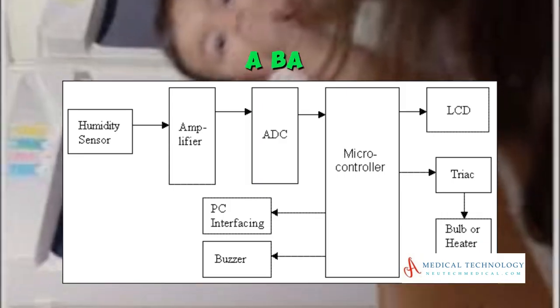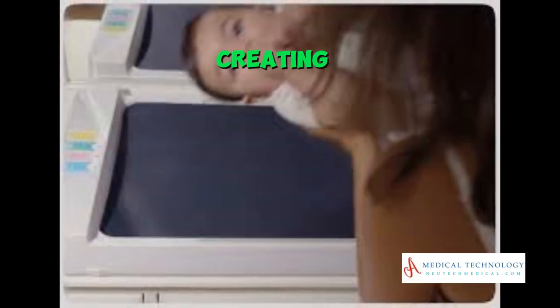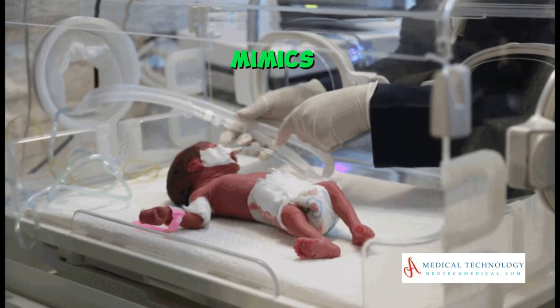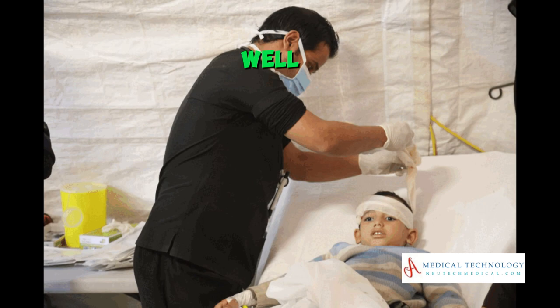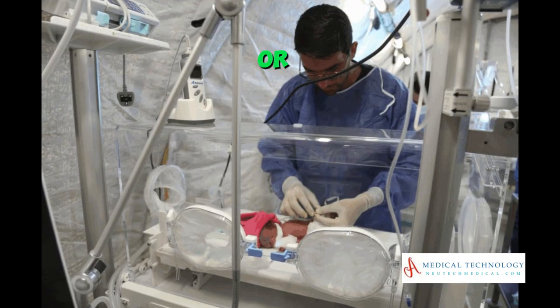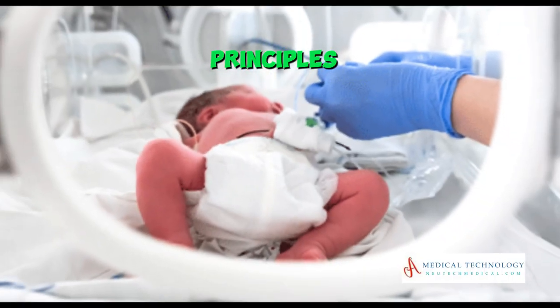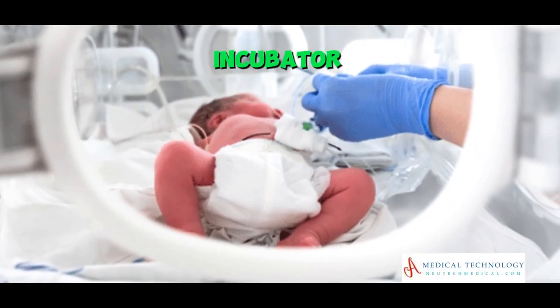The working principle of a baby incubator is based on creating a controlled and supportive environment that mimics the conditions of a mother's womb to ensure the well-being and development of premature or ill newborns. Here are the key components and principles involved in the operation of a baby incubator.